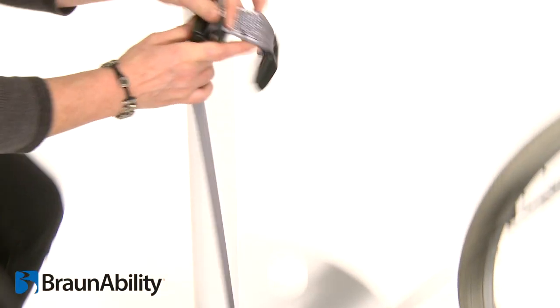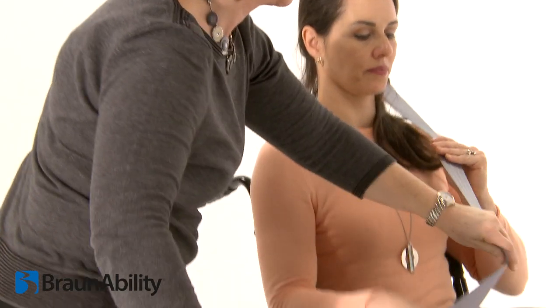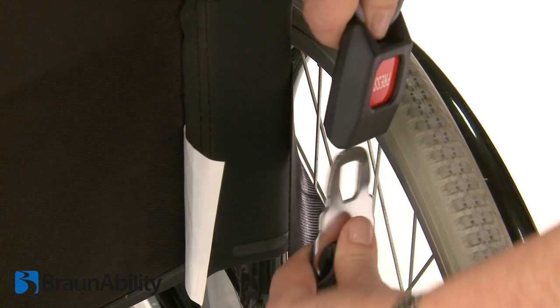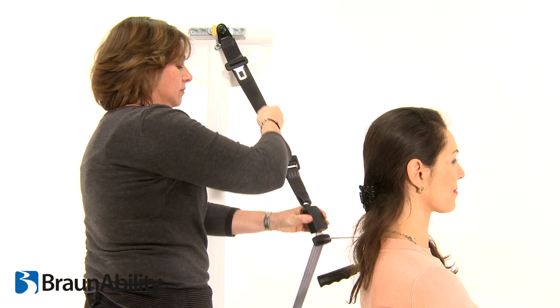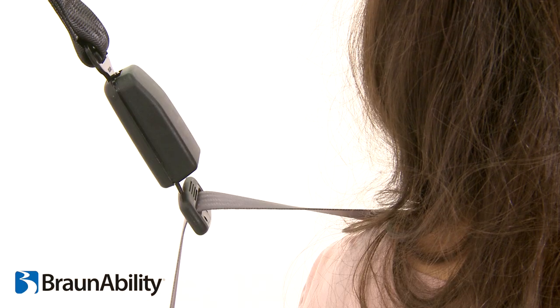Fit the grey shoulder belt tongue into the third fixing point buckle. Position the grey webbing to form the shoulder belt and insert the tongue into the buckle. Adjust the height of the shoulder belt to clear the occupant's shoulder by approximately 25mm or 1 inch.